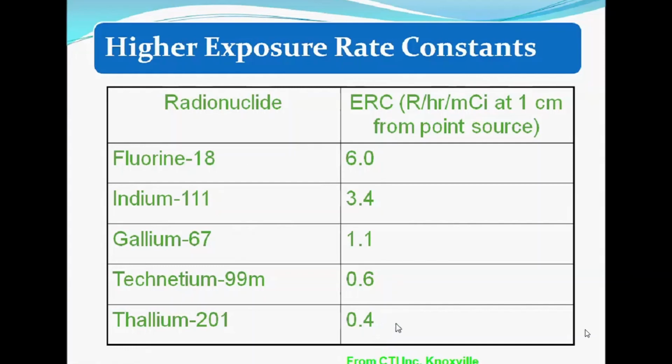How to prevent contamination? Because fluorine-18 is a positron emitter. So first it emits a beta positron. If you get contaminated, then beta plus means the positron delivers its complete dose in a very short range. So that is going to be much more harmful for us. So we have to be very cautious and should not get contaminated.